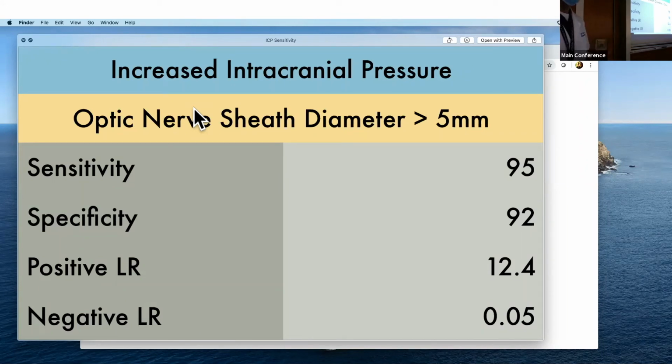doing an LP, all these invasive procedures, can I use this as an effective screening study to say, well, all right, it's good enough with that 5 millimeter diameter that if that's not positive, I don't have to go down that pathway. I don't have to, especially in a resource-deprived environment, take up that MRI. People who are self-pay, give this person a $3,000 a night bill to stay in the hospital so they can see Peds Neuro tomorrow. Making those types of decisions. And evaluating a sensitivity that high, yeah, I probably should think of how I might be able to change my practice in regard to that.